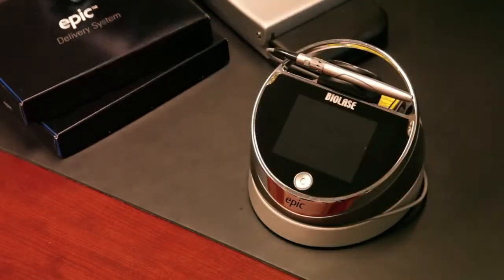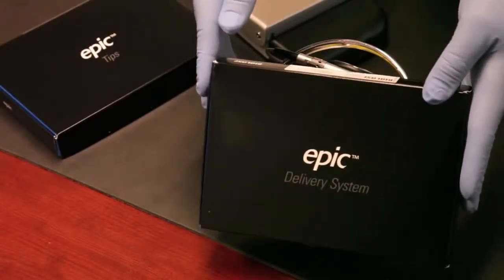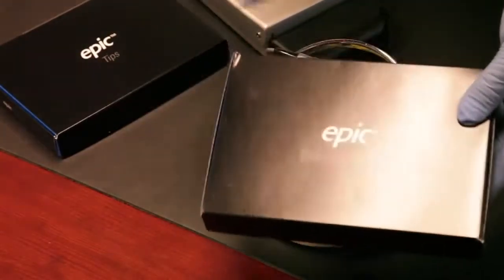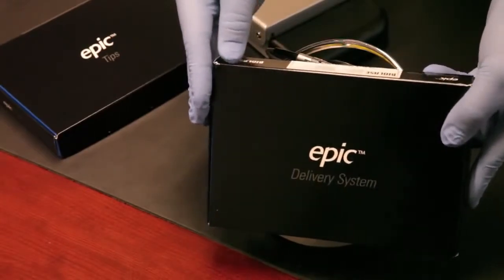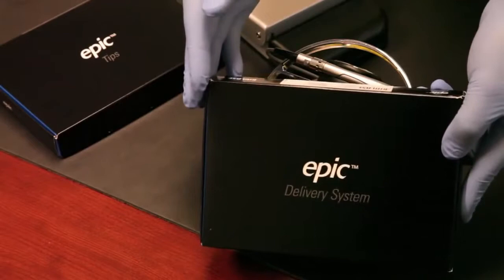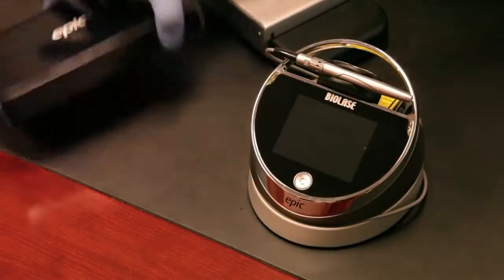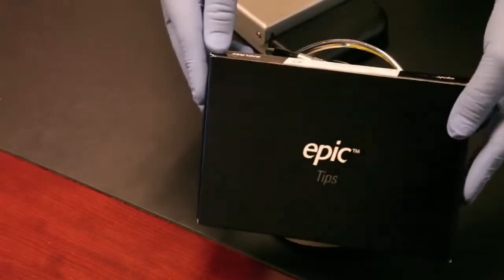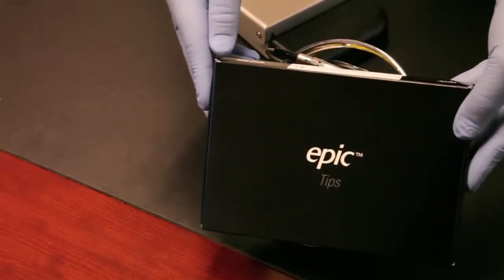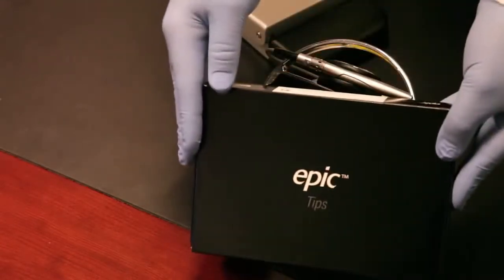The delivery system also comes in a package inside the Epic box. You'll open this up and actually install the delivery system when you get the laser in your office. Very easy to do with good step-by-step instructions. The system also ships with a box of 30 disposable single-use tips that you'll apply to the surgical handpiece.